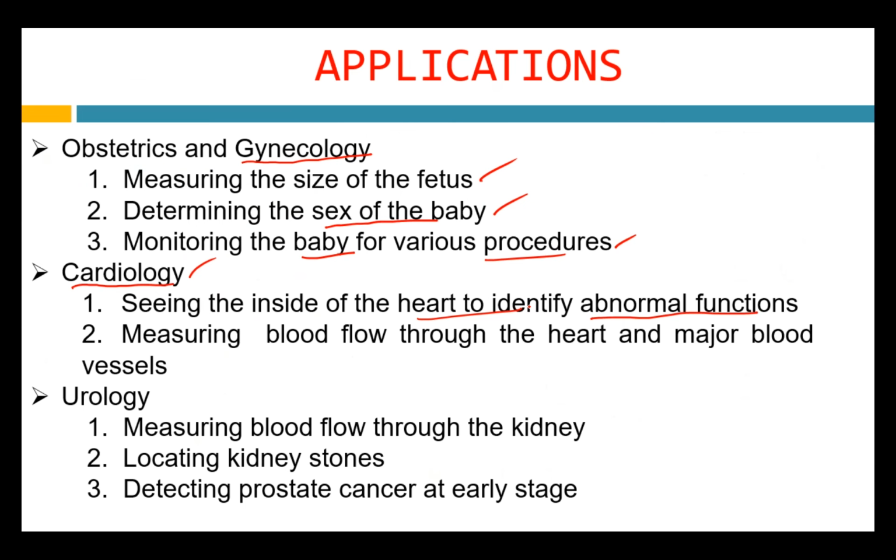Any obstacles or blocks can be found, so at least for initial screening we can use ultrasound. And one of the important functions is monitoring blood flow using ultrasound.